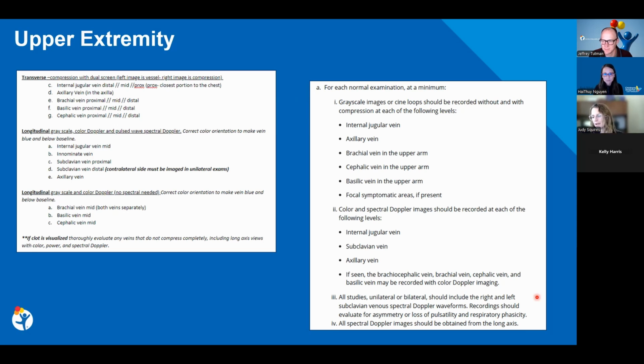I will say, I think the only time I can remember it being useful was when it's a kid with history of multiple prior catheters. They ask us to look at one side and then the other side happens to be out also. So the comparison has been like, oh, well, that side's out too. Don't go there either when you attempt to put your next line in. But I can't say it's been helpful for any of the lower pretest probability cases.